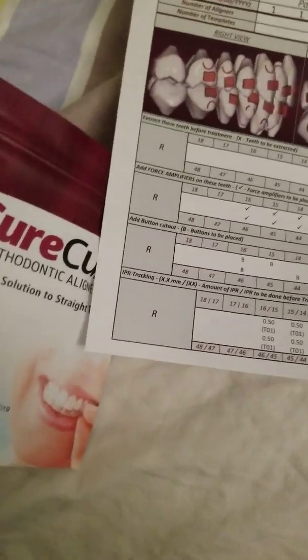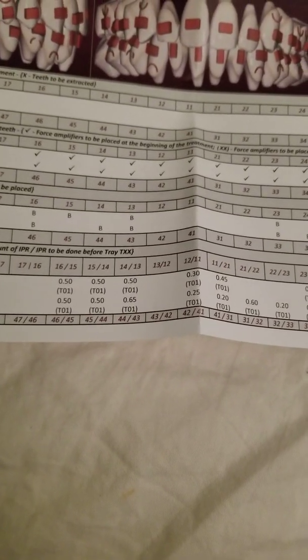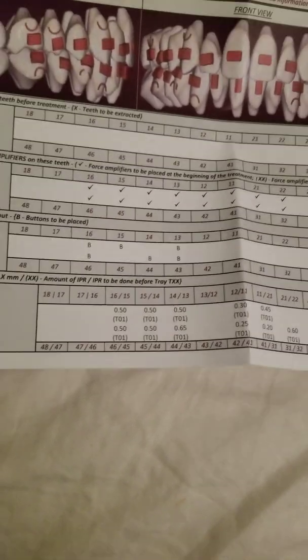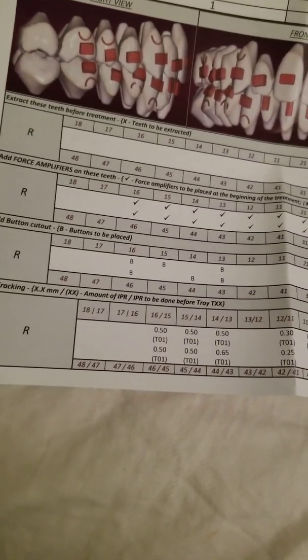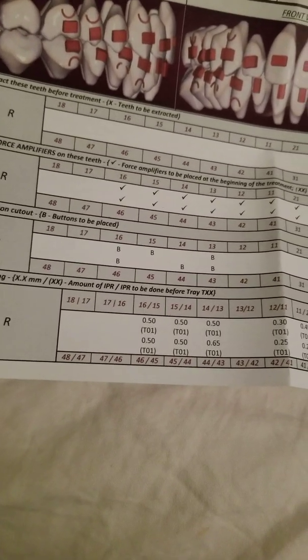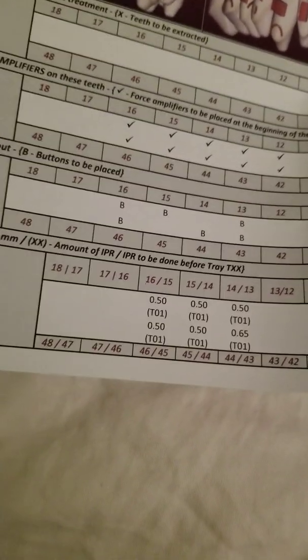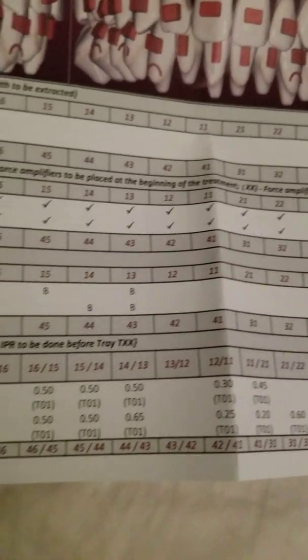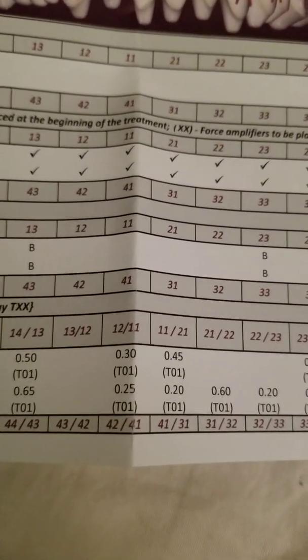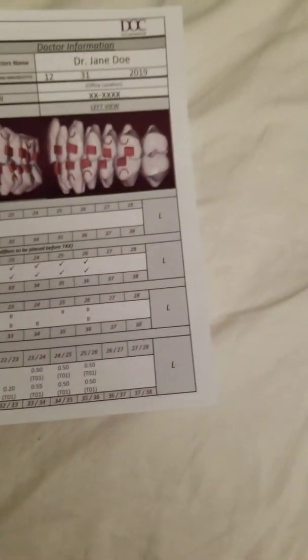That's the main thing. This is where the IPR is going. So these are all kinds of IPR, where to put them. These are the Canadian numbering system. That's why I'm all confused. All right, this tells you where to do it, where to stage it, the interproximal space, 0.5, 0.5, 0.5. Whoa, 0.65. That's an awful lot. Okay. I don't get this. Oh, this is lower. That's so confusing. All right. 0.6. Oh, that's a lot of IPR. Holy cow. All right, so anyways, that's pretty much how that works.